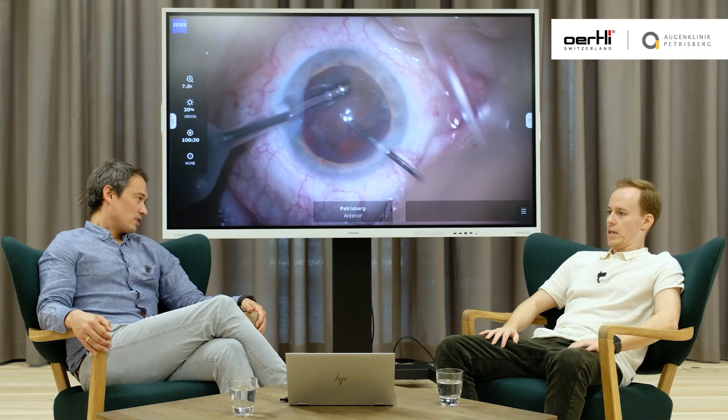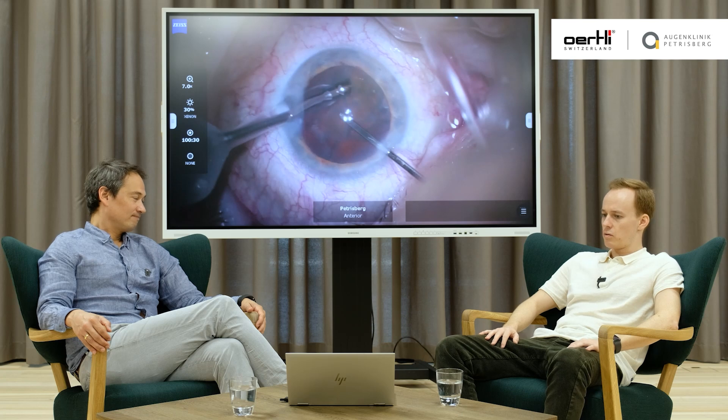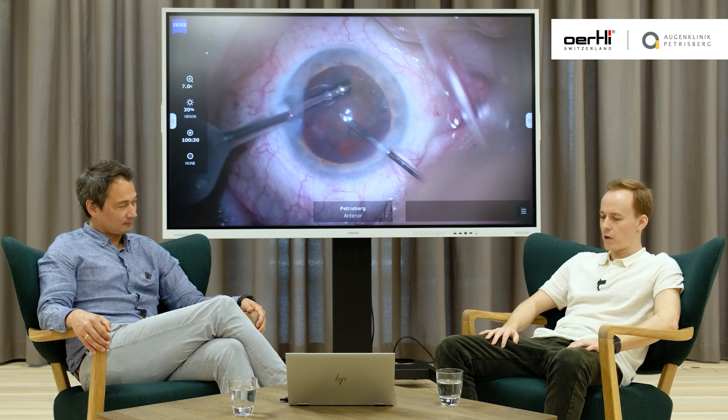So if you see a rupture, what would you recommend? The first thing you need to do is analyze the situation. Try to understand what's happening and do not rush to go out with your instruments. Just be patient. Calm down and analyze the situation — see what the problem is. Take a deep breath and look into the microscope, maybe hold on even for a couple of seconds. That's the first thing to do. Very important: don't get out of the eye with the instruments. Just stay in.